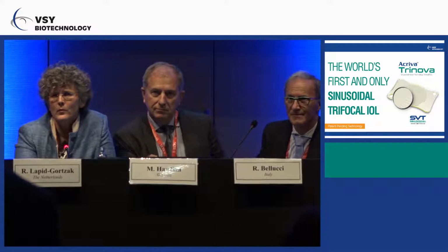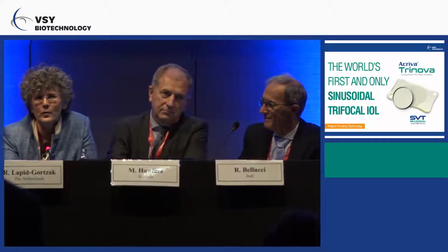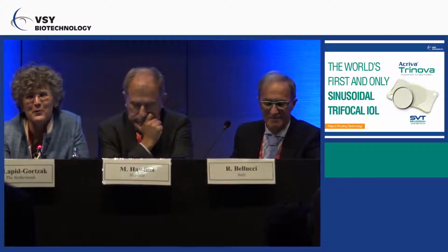I think this is basically a trifocal IOL with a very good continuous line of vision from distance to near. So if you have good continuous vision, you could use the marketing term of extended depth of focus. However, this is a very new innovation, and the data are not out yet on how completely the optics were done because of patenting issues.